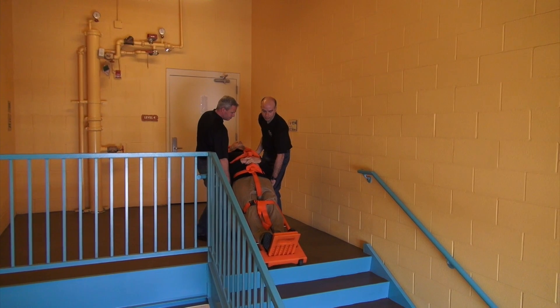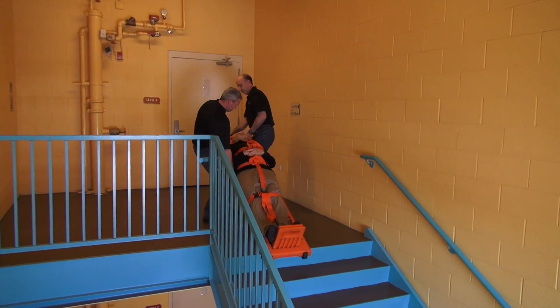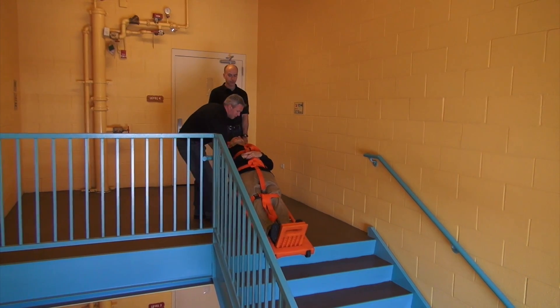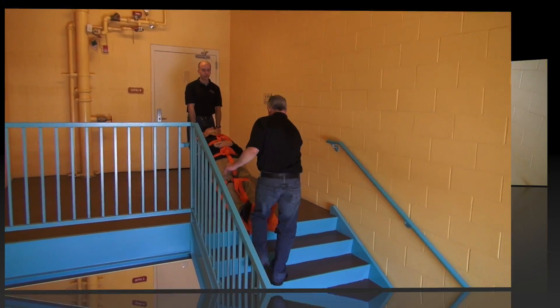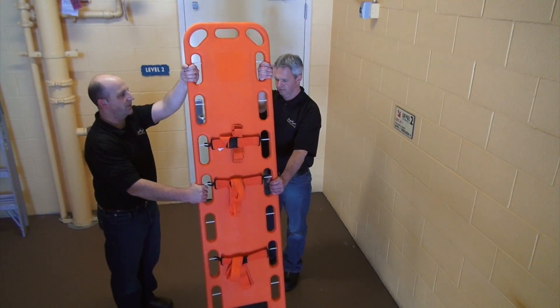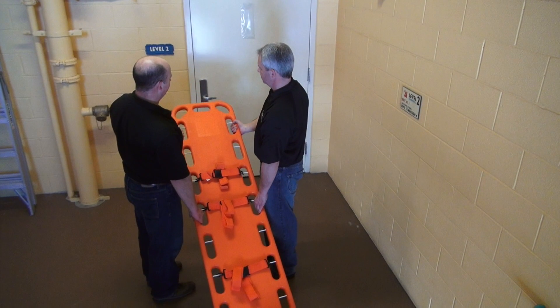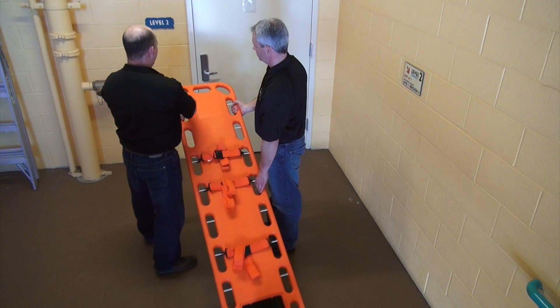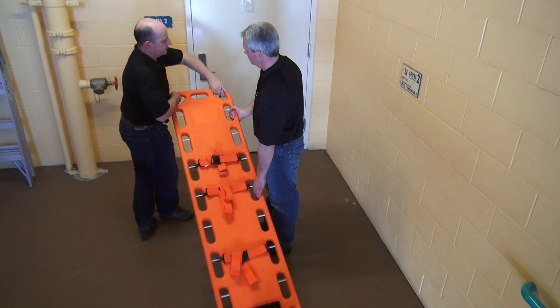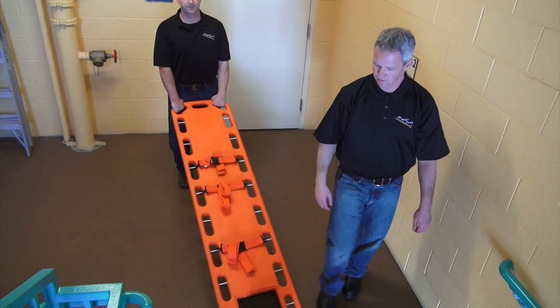Before going downstairs, you will need to transition from two-person to one-person operation. If done incorrectly, the patient could tip. The proper technique is to stop moving the walkboard and lower the board to waist height. Notice how the paramedic's arms are straight, not bent — they're letting gravity do the work. One paramedic maintains a firm two-hand grip, while the other paramedic always keeps one hand on the board throughout the transition.